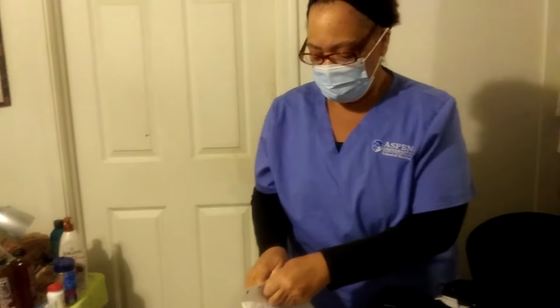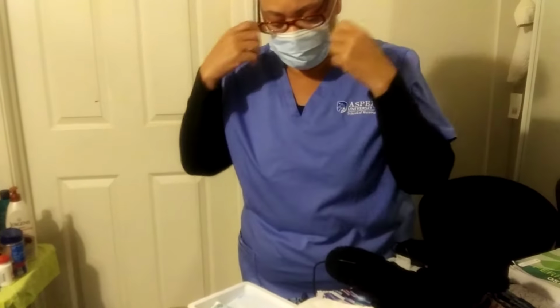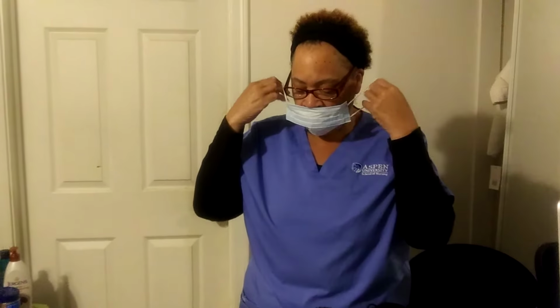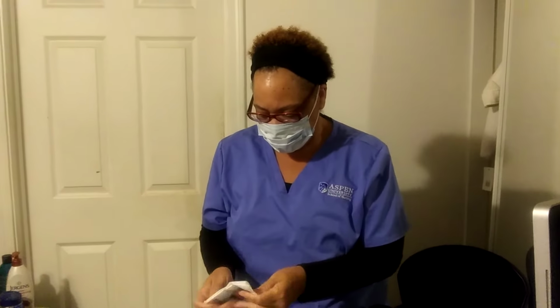So I open up my sterile kit. Oh, it has a mask. Okay, sorry. It has a mask. So I use the mask out of the kit. Here I have my mask on. I'll get my sterile gloves out of the kit.